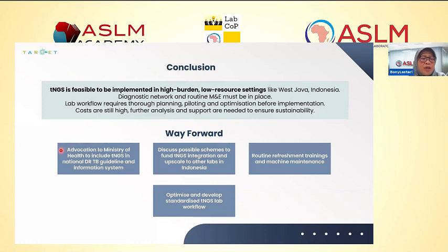As the way forward, first, we will continue advocating to the Ministry of Health to include tNGS in the national diagnostic algorithm. We just had a meeting with the NTP last week, and maybe we don't do tNGS for all newly diagnosed patients, but focus tNGS on solving problems in complicated cases. We also look at possible schemes for sustainability, how we can fund tNGS tests in Indonesia and in other labs. Then routine refresher training and machine maintenance, and also optimizing and developing a standardized tNGS lab workflow, because we hope more labs in Indonesia can perform this test.